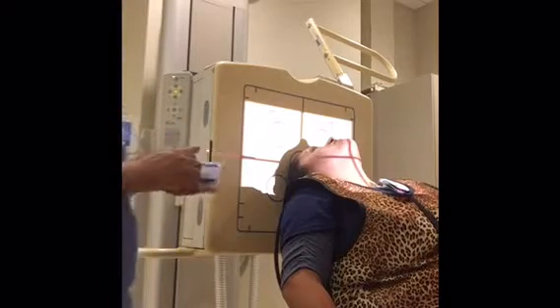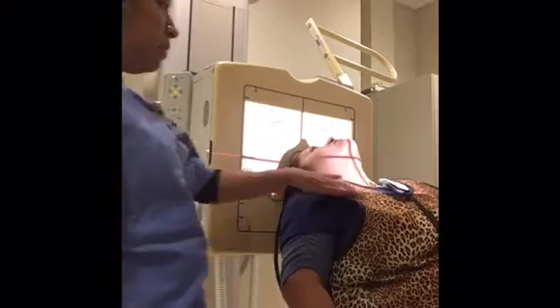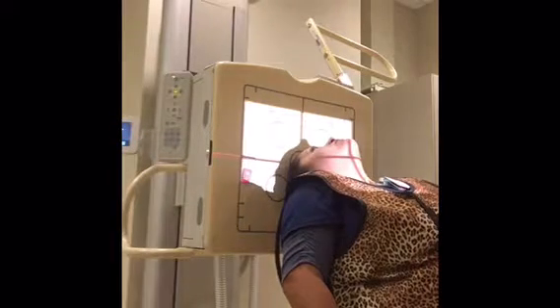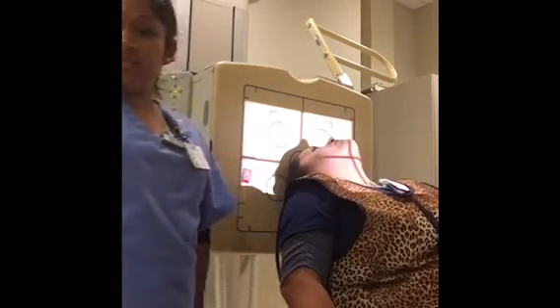We're going to use our right marker right here, and we have our patient shielded, and we have our patient positioned. So now I'm going to have you hold your breath. Okay, x-ray, beep. Okay, you can breathe and relax, and now we are all done.